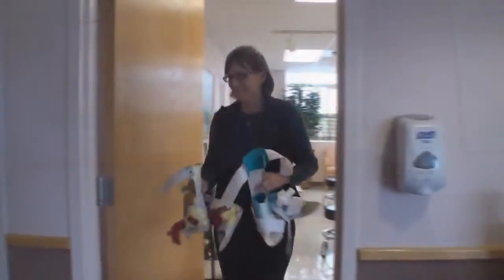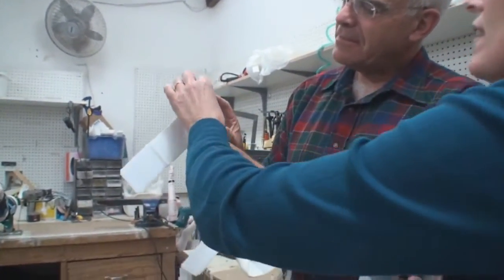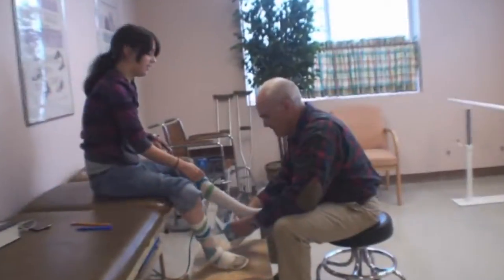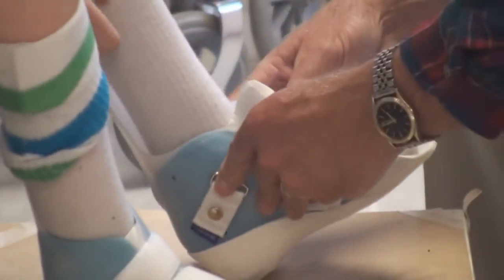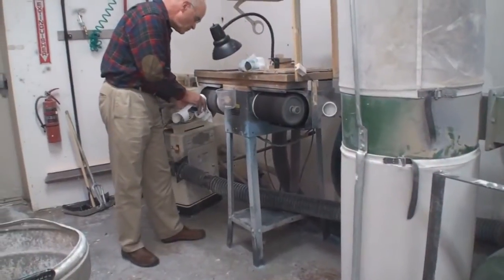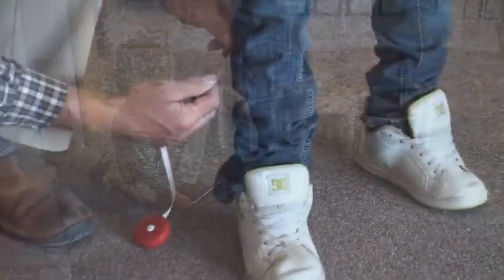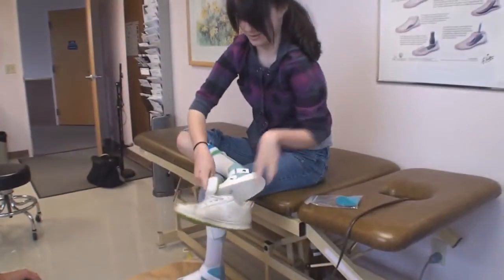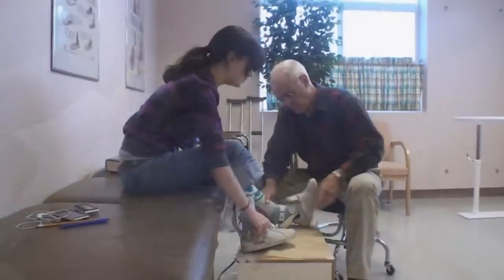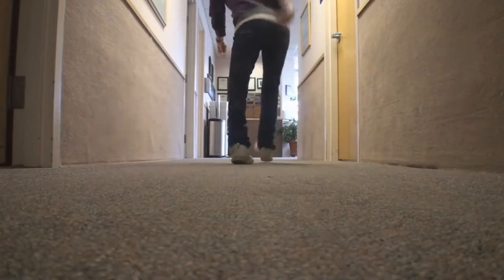We're here to maintain the brace over usually the year to year and a half that it'll fit a teenager, slightly less than a year on a young child. We also help with the initial fitting, where the first two, three, four weeks sometimes there are some pretty intense adjustments as the braces get settled in and the person gets used to how they feel. The first fitting, there isn't a lot you can find out — they usually have to find some shoes, and they haven't worn it enough to develop any soreness. It's similar to buying a new pair of shoes: you can tell whether it sort of feels good, but the next few days will tell you a lot.